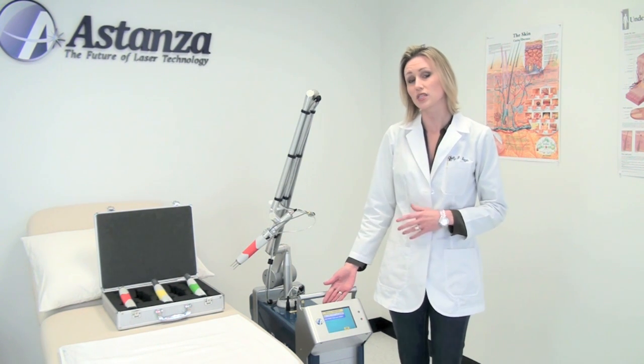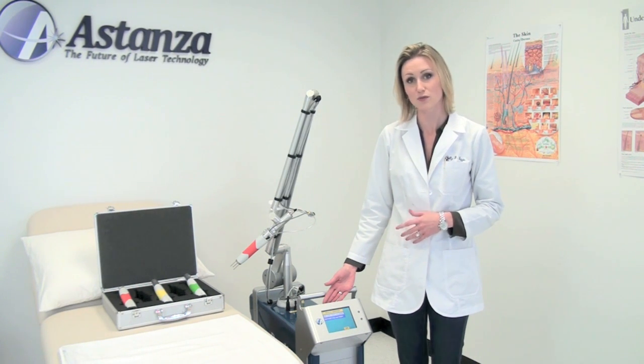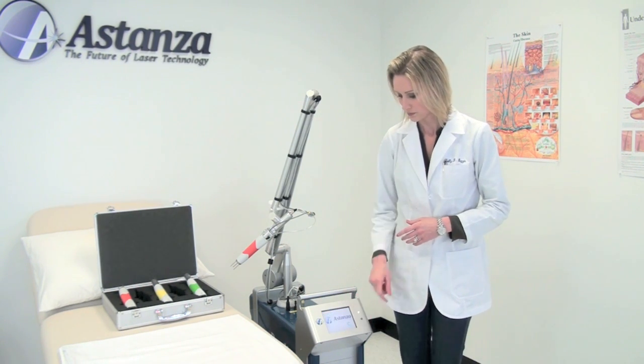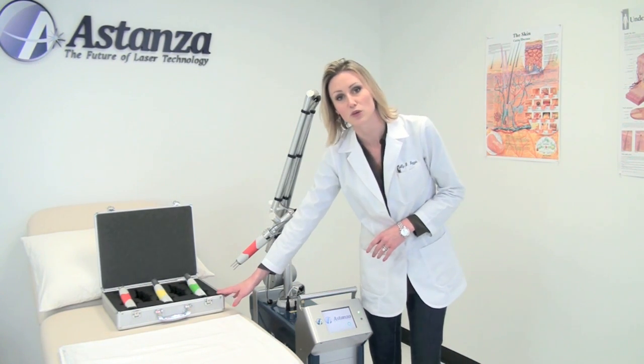It immediately allows you to select between the 1064 nanometer and 532 nanometer wavelengths for tattoo removal. It takes a few seconds, and while we're doing that, we'll look at the hand pieces that we have to work with.